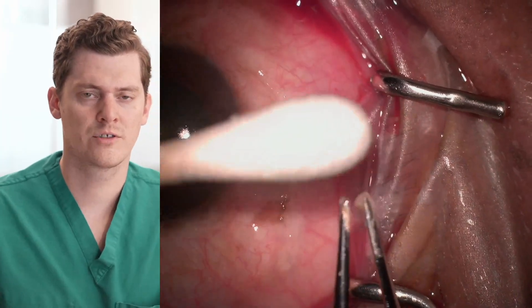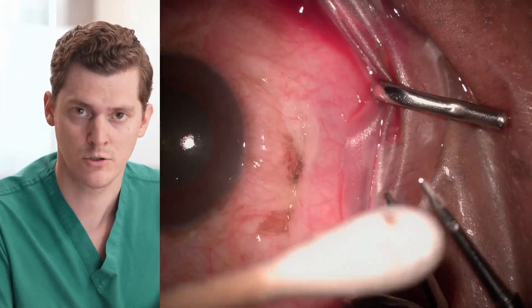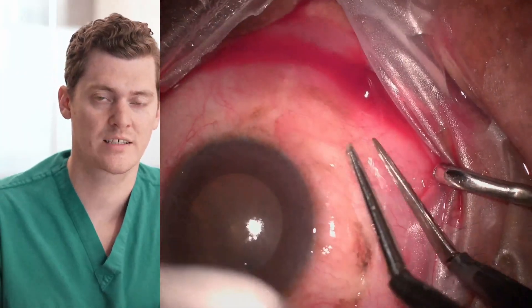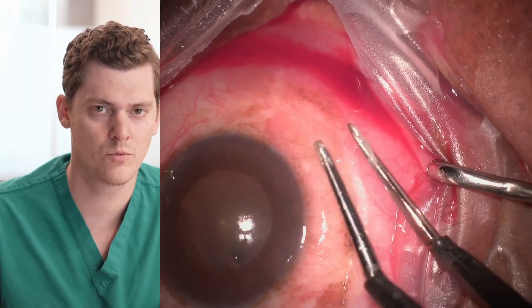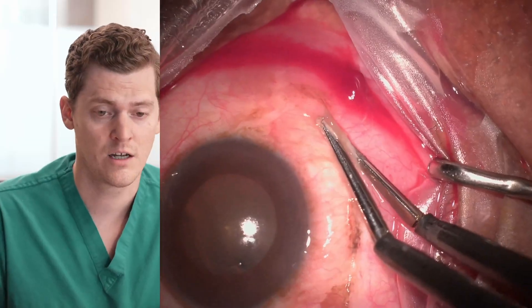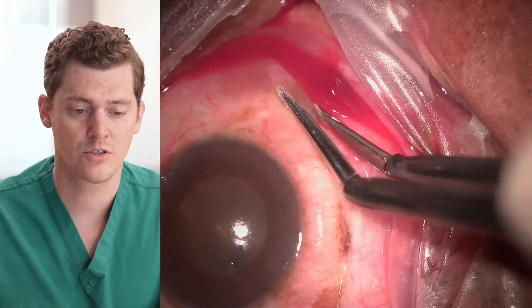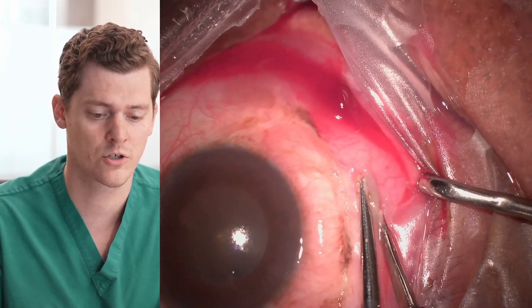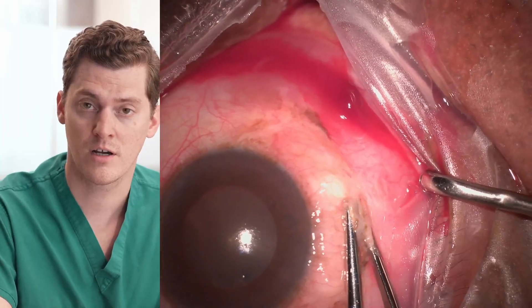What are other techniques we could use to treat conjunctival chalasis surgically? Well, the most common is probably surgical excision of the excess conjunctiva. However, that's usually a lot more tedious and cumbersome — we run into a lot more bleeding, we need sutures, oftentimes need glue. So it's very expensive and time-consuming compared to what we're achieving here with the cautery.